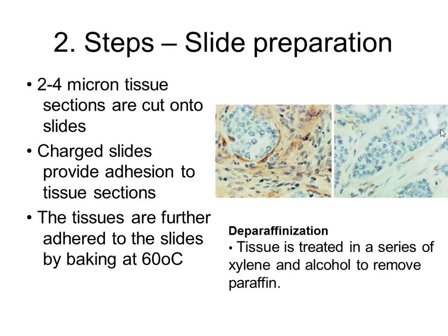After that, we must make a deparaffinization of the tissue. The tissue is treated in a series of xylene and alcohol for the removal of the paraffin.